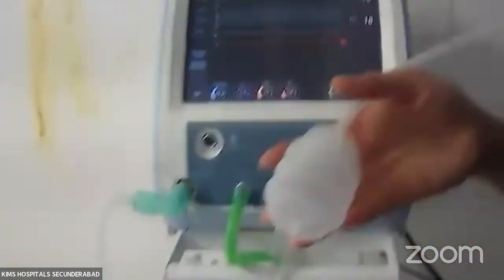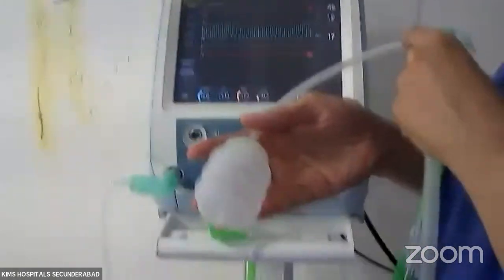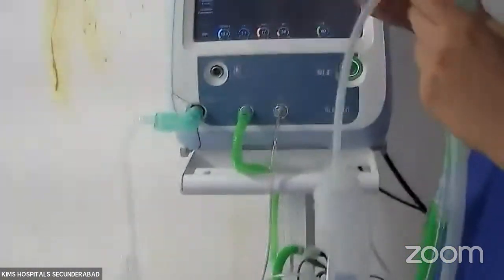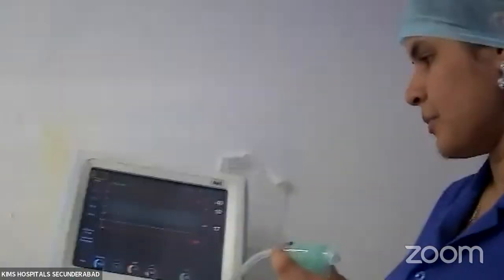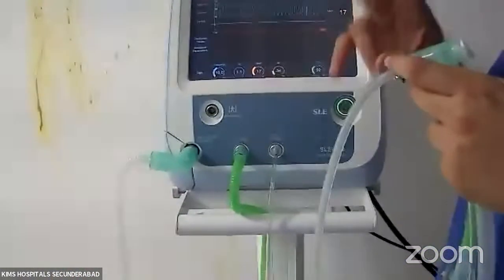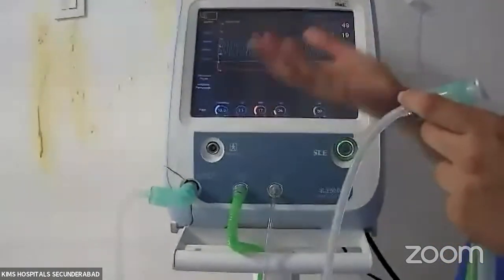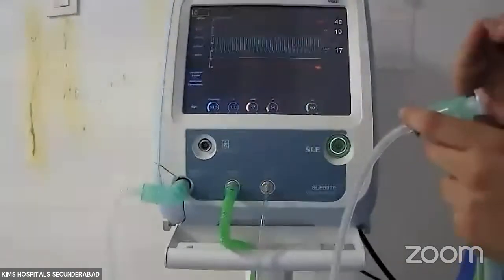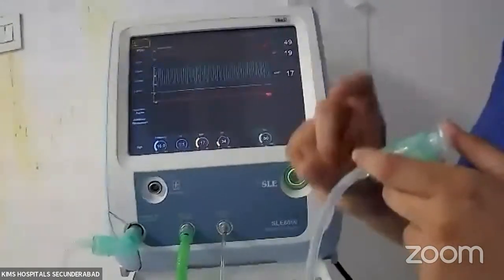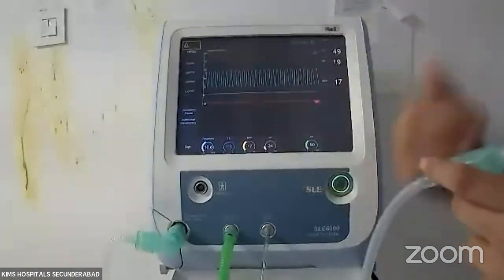Okay, so once you start the HFO, you can see that the oscillations or wiggles can be ascertained from the baby's chest, and usually we look for wiggles until the umbilicus. The other parameter that we would be setting is the frequency, which is decided by 2 parameters. One is the patient size, and second is the underlying time constant of the disease that we are dealing with. So smaller the baby, more will be the frequency. Shorter the time constant of the disease, like RDS, if we are ventilating with HFV, again, higher will be the frequency. Larger the time constant, lesser will be the frequency.